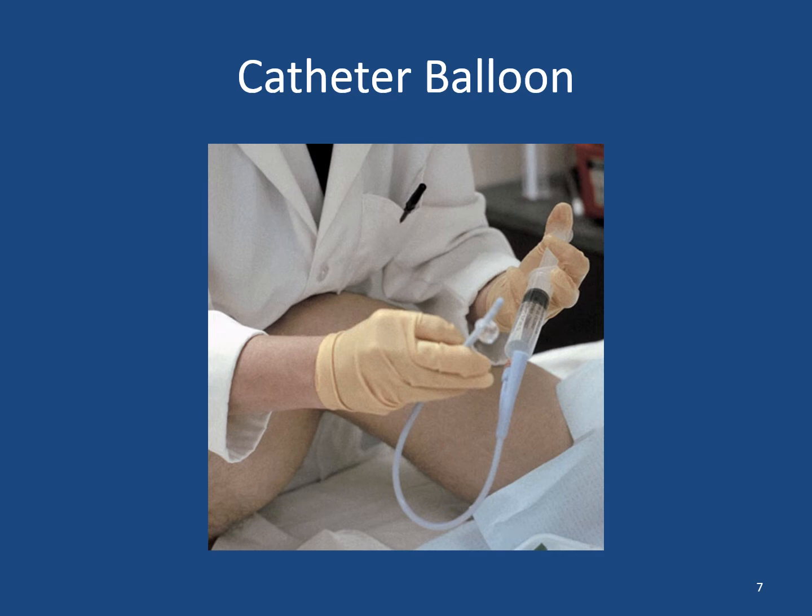You will get the opportunity to inflate a balloon outside of the patient in the lab, and you will be able to see with some of these catheters that have been used over and over again for practice that they do have ridges on them.